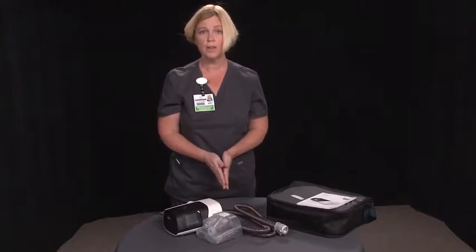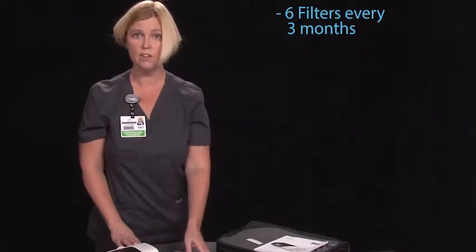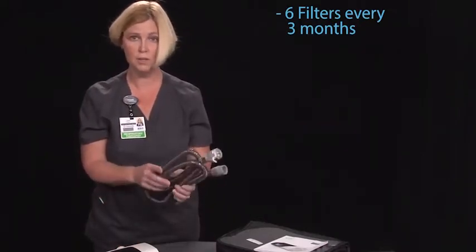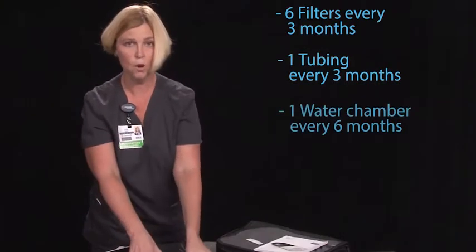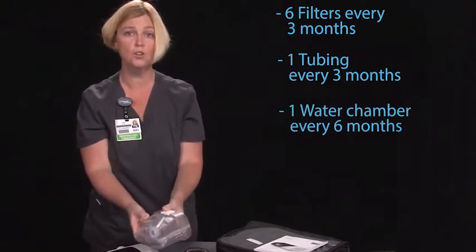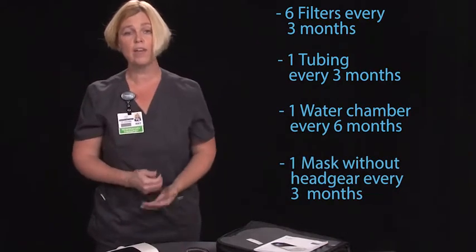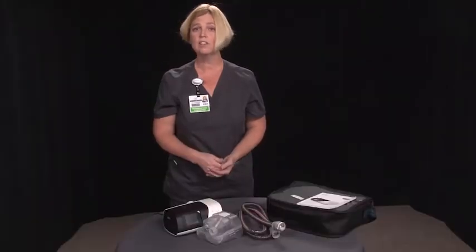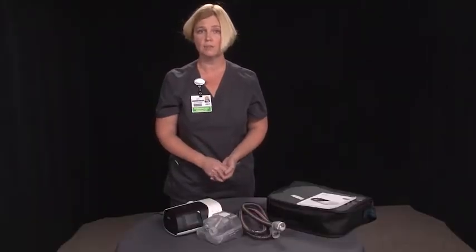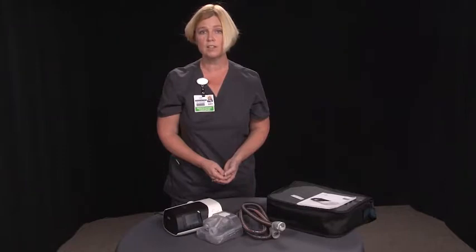The things that you replace are your filters. You can get 6 of those every 3 months. Your tubing, you can get 1 new tubing every 3 months. Your water chamber, you can get 1 new water chamber every 6 months. And your mask without the headgear, you can also get every 3 months. The headgear itself, insurance only covers that every 6 months. You may choose to private pay for any of these items at a 40% discount from us, or you can look online to see what is available.